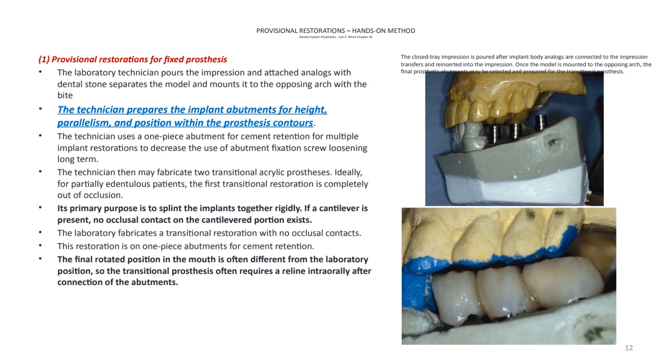We don't want to put too much pressure on the implants at any time, because that can lead to different problems, from the implant screw being loose. Also, the restoration can be broken if the contact is too tight. When the patient bites down on the temporary, it's plastic, so it's not as strong as porcelain or ceramic materials. So therefore, it can break very easily.